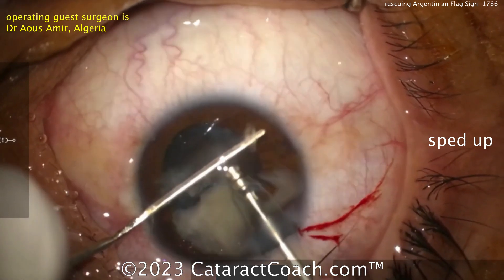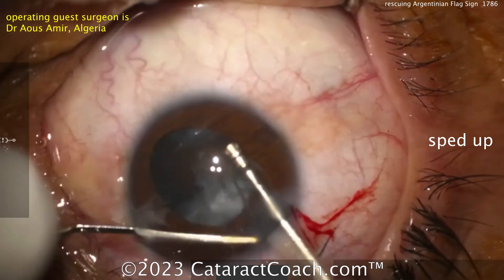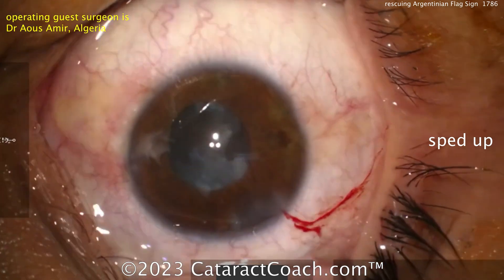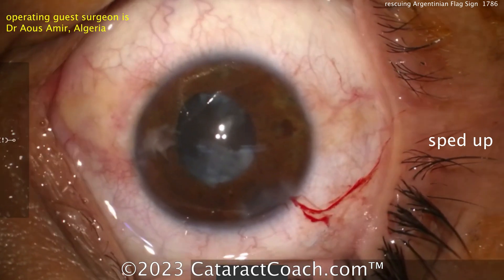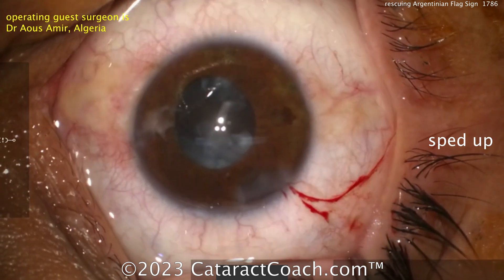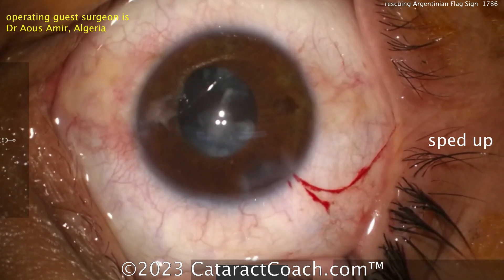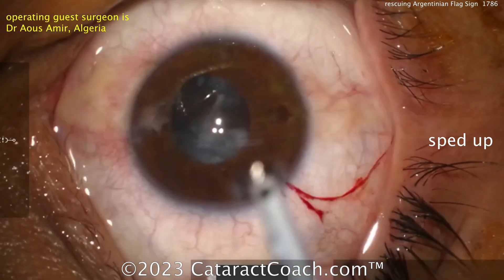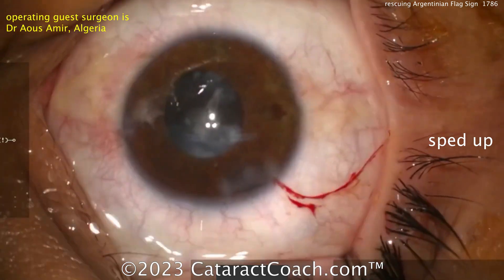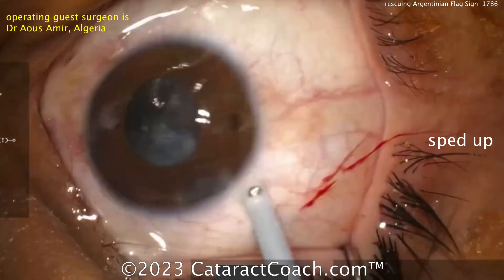Just emulsify them up a little bit at a time and those will come out pretty easily. The nucleus will come out fine, but for cortical cleanup you have to be very careful — you don't want to pull on that anterior capsular flap because that'll rip right out too. You can do a bimanual or coaxial approach, and you may want to do that one area where the run-out was last.